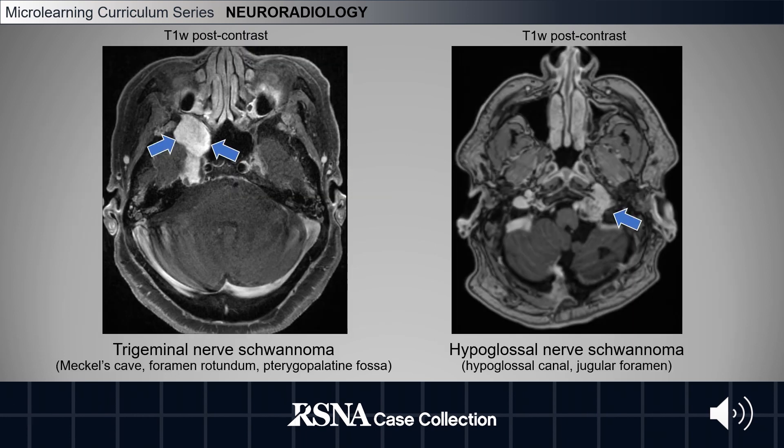Here we have T1-weighted post-contrast images of a trigeminal nerve schwannoma on the left and a hypoglossal nerve schwannoma on the right, as denoted by the blue arrows. Pay special attention to key anatomical structures that are related to each cranial nerve.